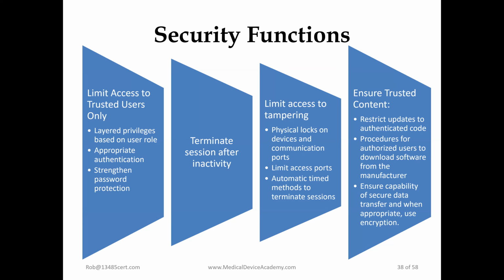If you have a physical component to your device, making sure that it has locks and covers on communication ports, those sorts of things.